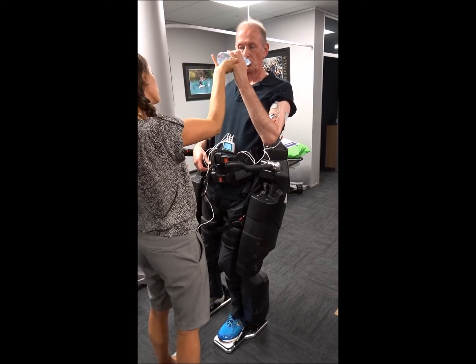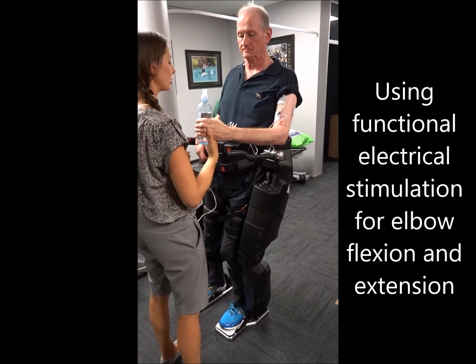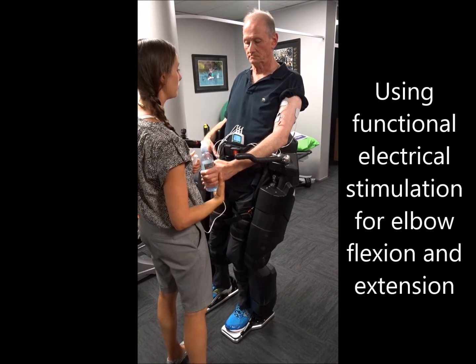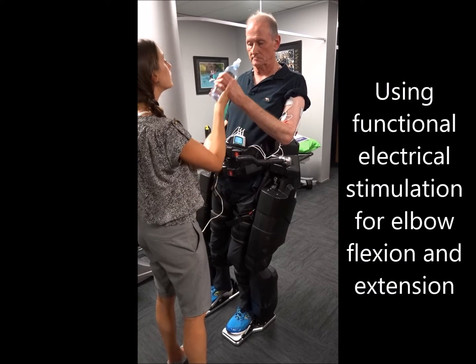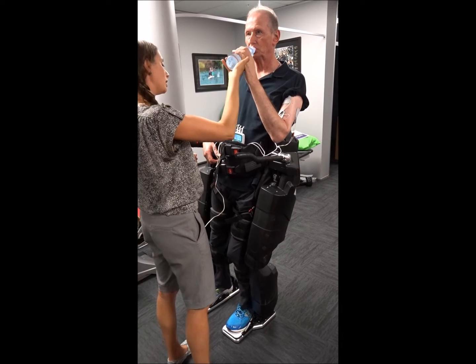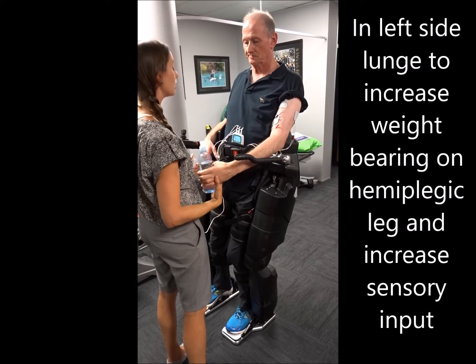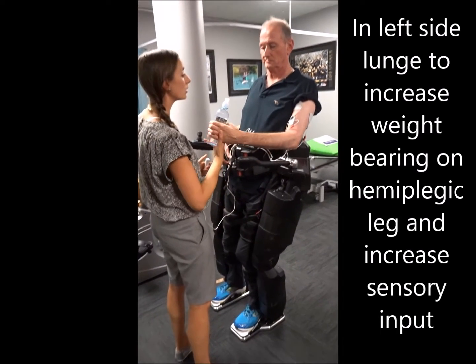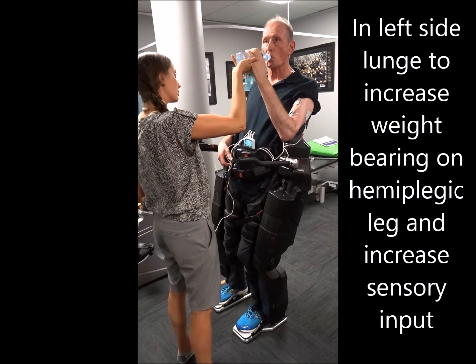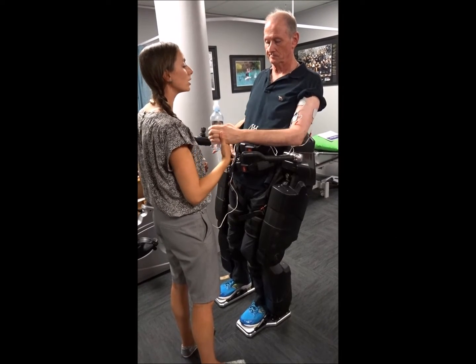And how do you do that? We can see how many people do this — we can just come down a little bit. Straight up. Straight up. Good. Out. Straight up. Two more. Up. Beautiful.